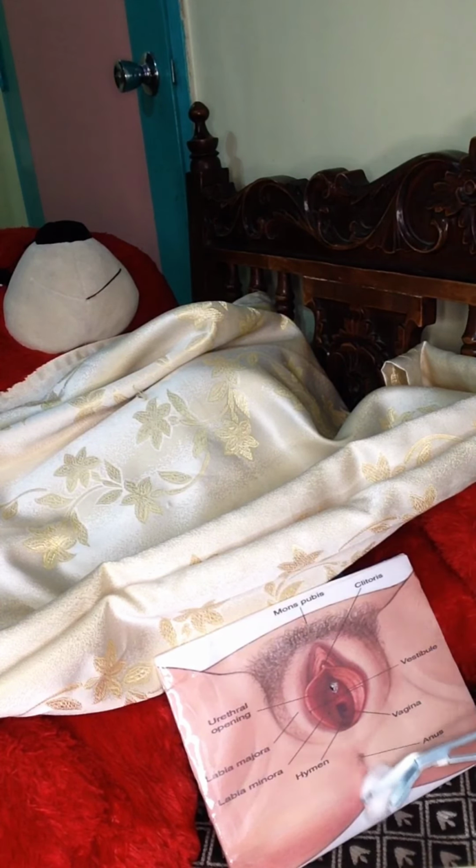Put the eye sheet to avoid infection. This is our eye sheet. Next is lubricate the catheter for about 1 and 1/2 inches, being careful not to plug the eye of the catheter. So first, we need to check if our balloon will inflate. With the use of our 10 cc syringe, we will check if our balloon will inflate.